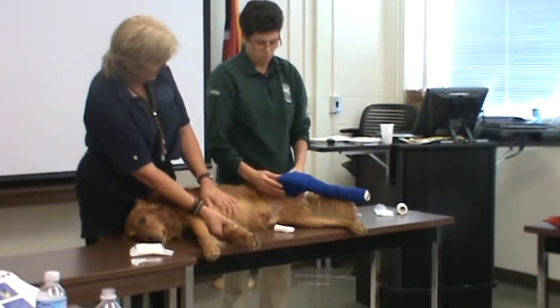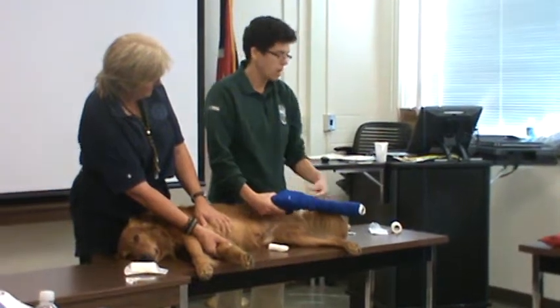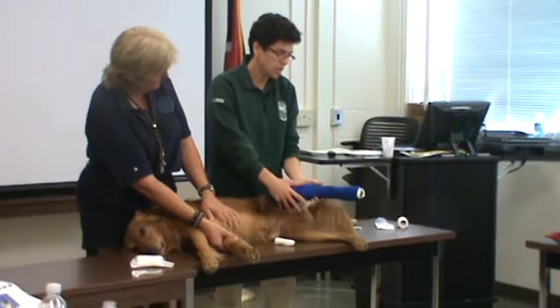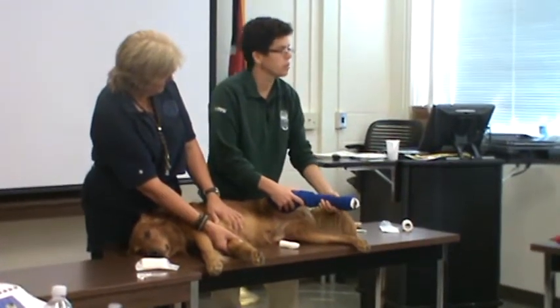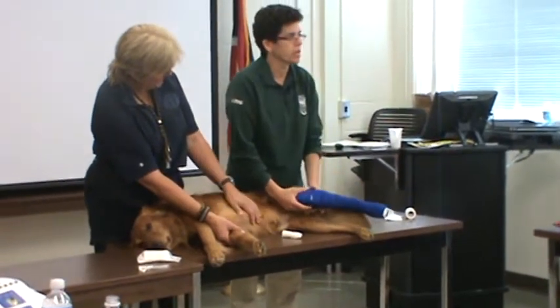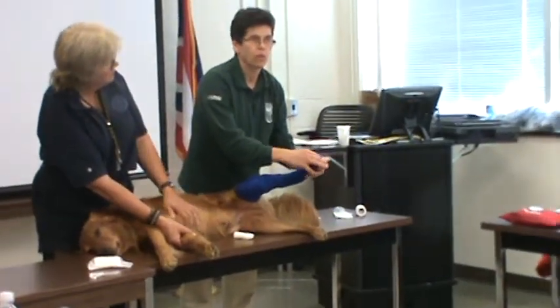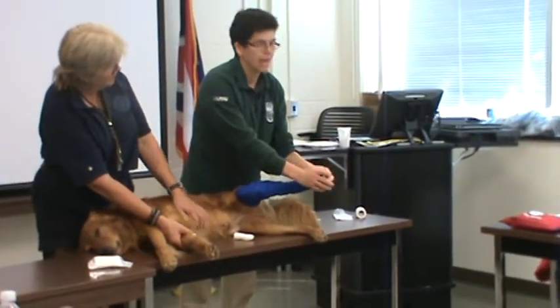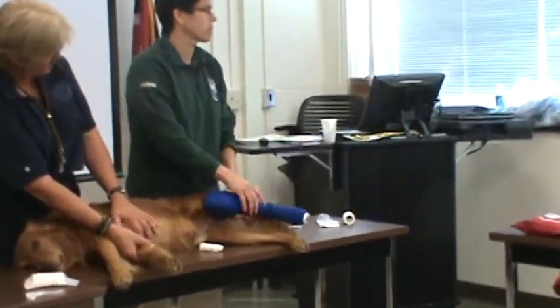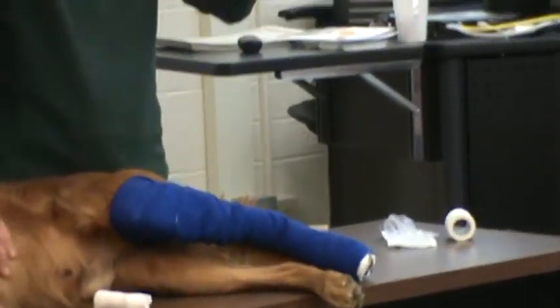Especially if they're moving a lot, that extra piece with the sticky stuff may help up at the top. But really, if I'm doing it right, it should actually stay on. This one is a little bit loose and it'll probably slip a little — I could have put a little bit more tension on it. But I wanted to be really sure we didn't overdo it, because that is going to be an issue. Notice we can still see the toes — we can monitor them for any swelling, any change, any odor. And if it gets soiled or they're bothering it, we have to take it off and replace it.